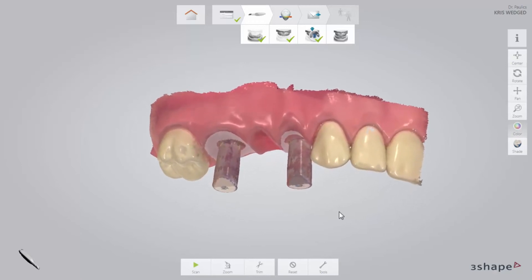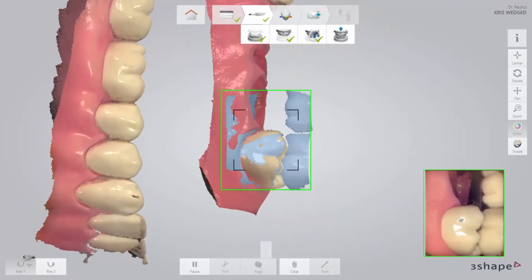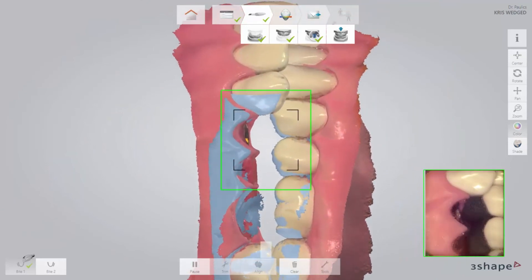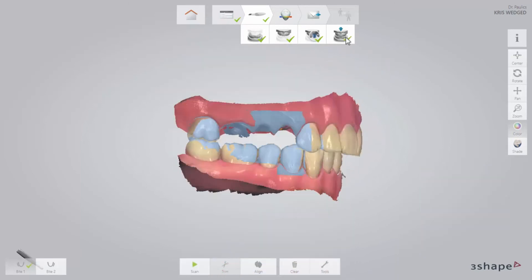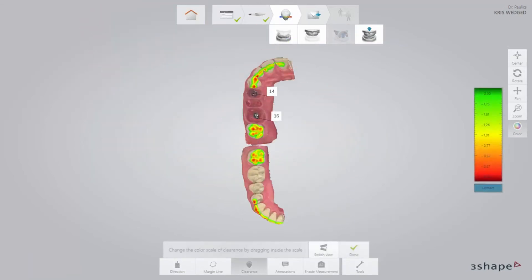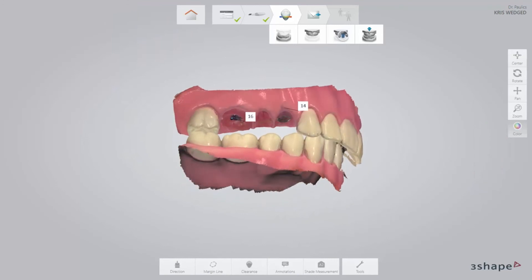When the scan has been added, remove the scan bodies and scan the bite. Ask the patient to bite firmly and scan until both scans snap into position and the jaws are aligned. The scan should cover at least three to four teeth for a perfect alignment, even if scans snap together earlier. Switch to the Analyze page to confirm that there is enough space for the reconstruction between the upper and lower jaw. Add some comments or take a shade measurement.